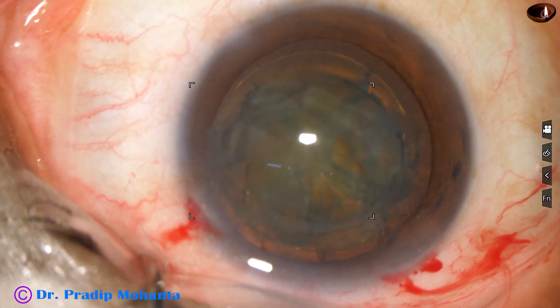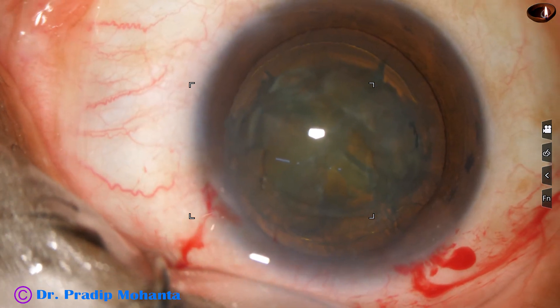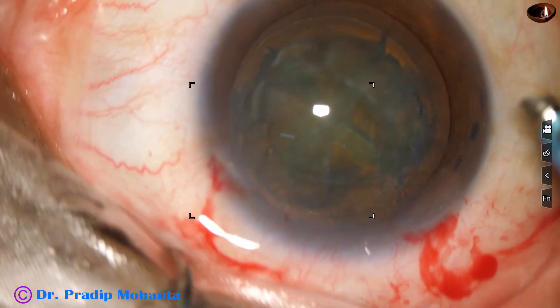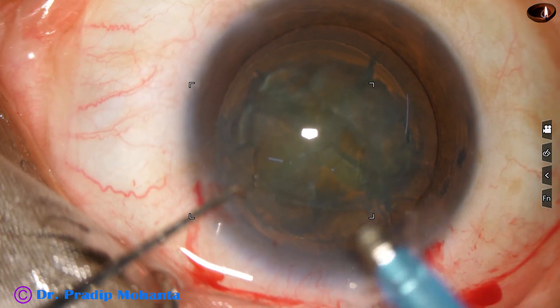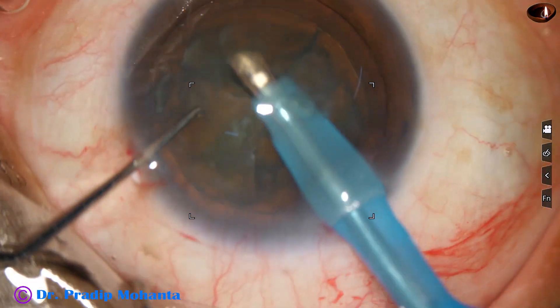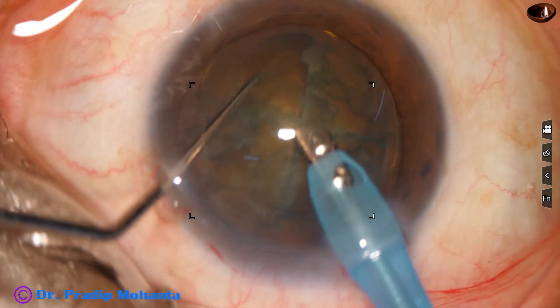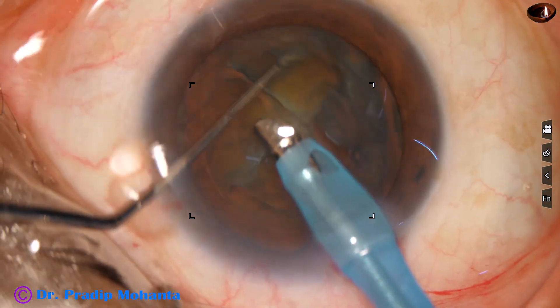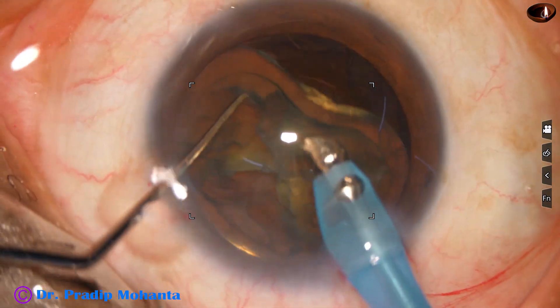This is a very useful instrument designed by Dr. Sohail Irfan Khan of Nanded, Maharashtra, India. You can design your own pre-chopper. Pre-chopping is very useful in soft cataracts because you cannot hold the nuclear mass. You can devise other techniques like mechanical chop or carousel, but this is easy — you can make a small rhexis of about five millimeters, divide the nucleus in the capsular bag, and you don't have to prolapse the nucleus out of the capsular bag.